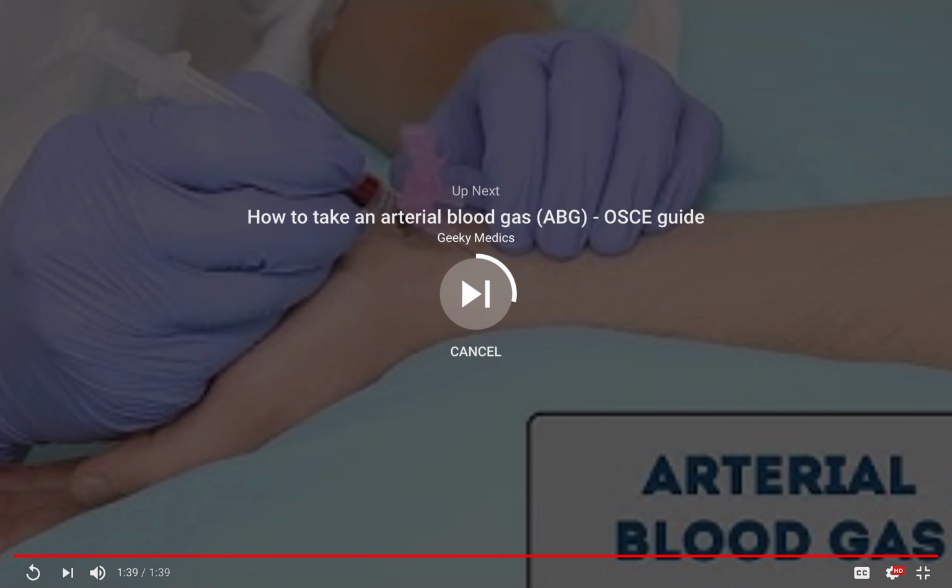Can I just check before we begin? Have you ever been told you have problems with your circulation? No. Okay. Do you take any blood thinners, such as warfarin? No, I don't know. Okay. And have you ever been told that you have problems with clotting? No. Brilliant. Can I also check, James, do you have any allergies at all? No, I don't. Brilliant. I'll just gather my equipment.